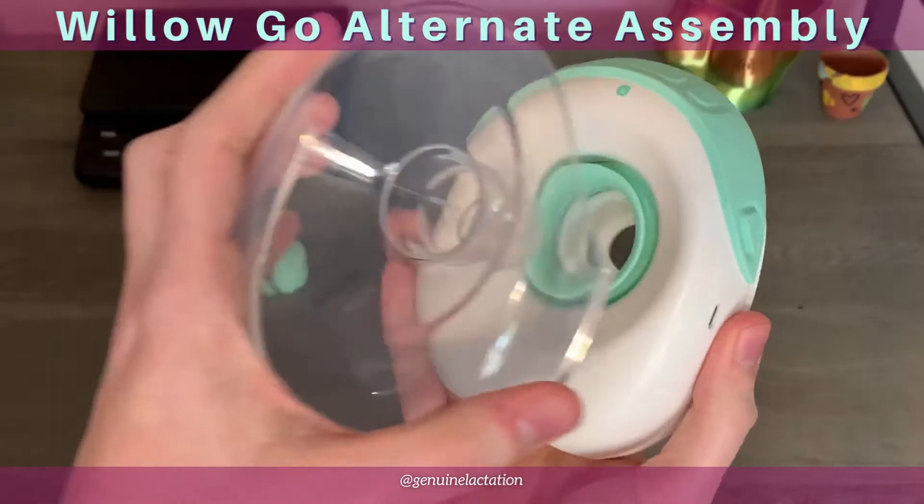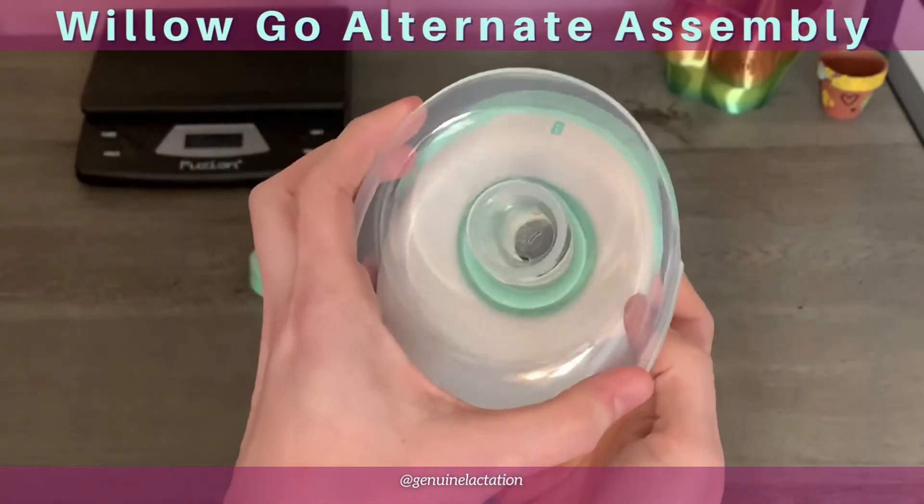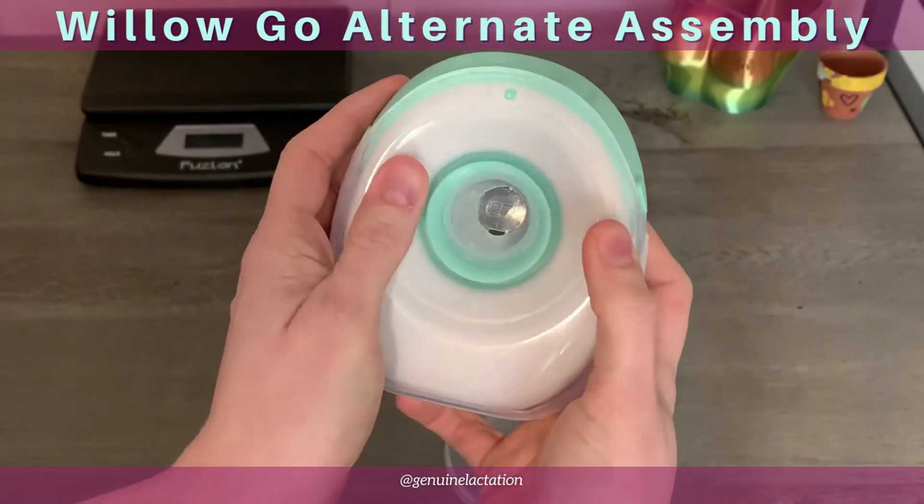Then you're going to take your flange, center it in this hole, and push it straight through.